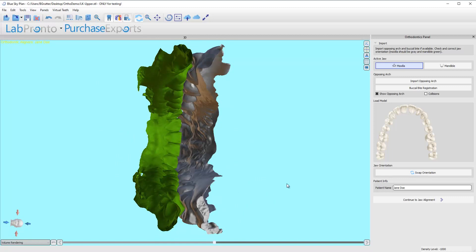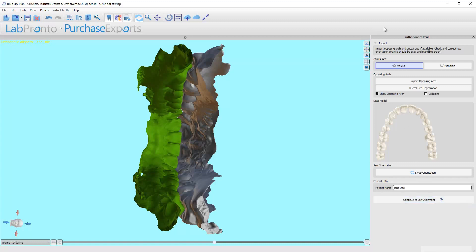All right so I'm gonna go ahead and click continue to jaw alignment right down here. We're always gonna be working from top to bottom.